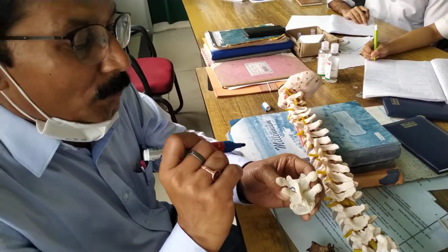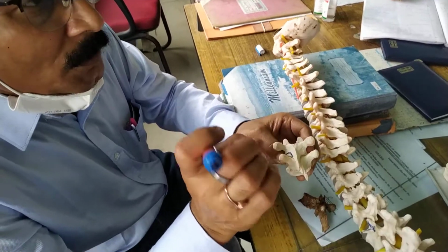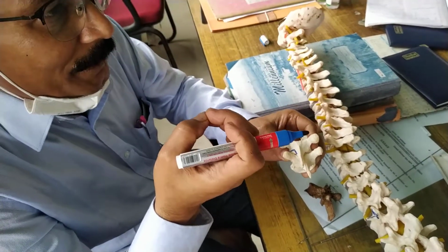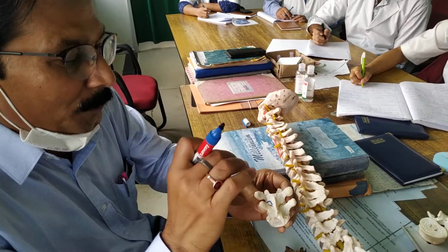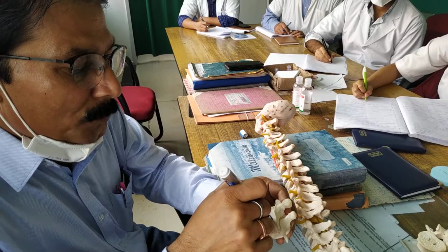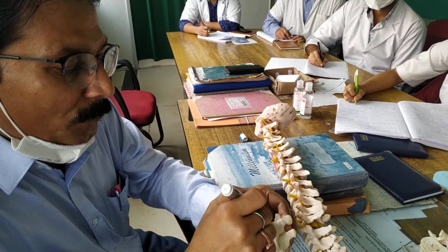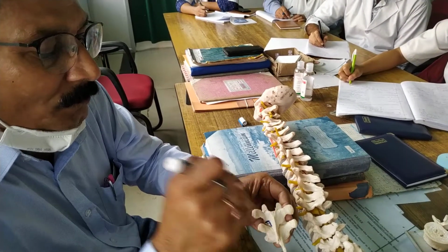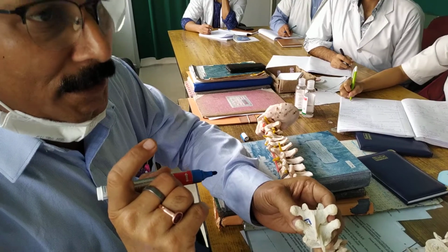So that is why, to find the superior articular surface, you necessarily have to remove or cut away part of the inferior articular surface of the vertebra above. So we are removing this part. Okay? Once you remove this part, you are going to find this area. Yes? Now, next, the orientation.